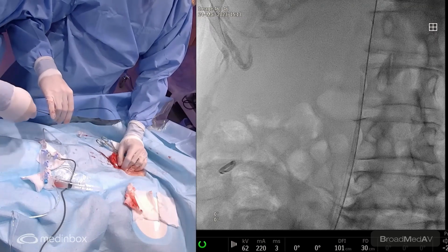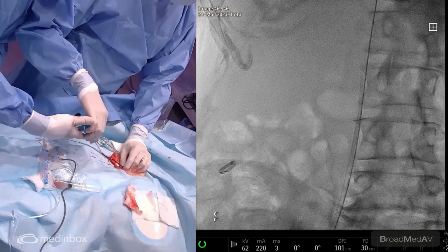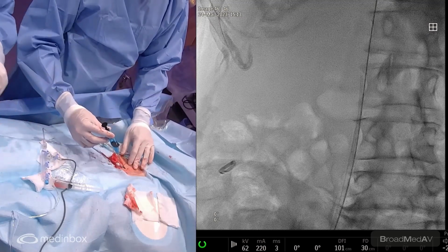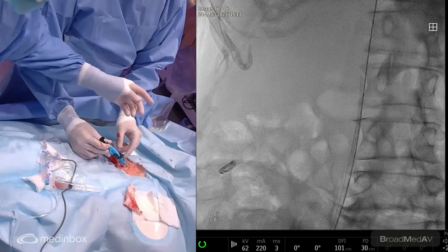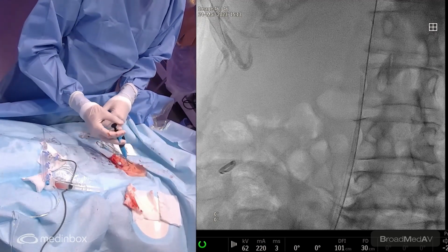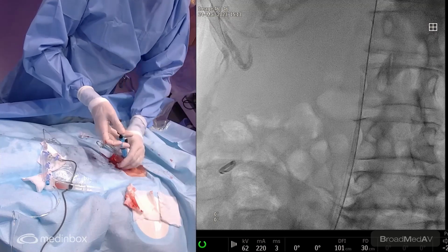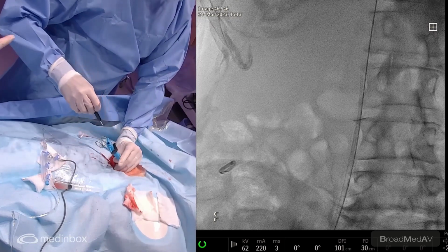So, second pre-closure. Okay. So, preclose on the wire. I will remove the wire at this point. It will advance without wire in the vein. It's pushing on the belly just to confirm some venous return. There's not much, but we are at the end of the day. And the patient is thin, so we have some blood return, confirming that we are in the vein.